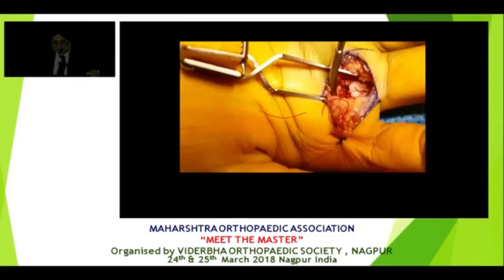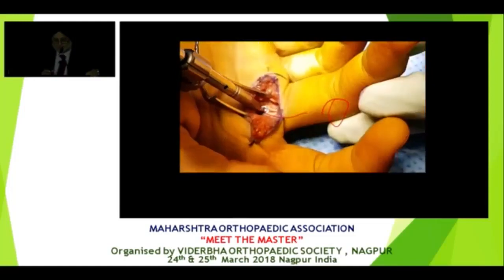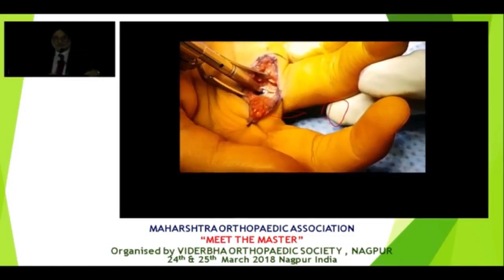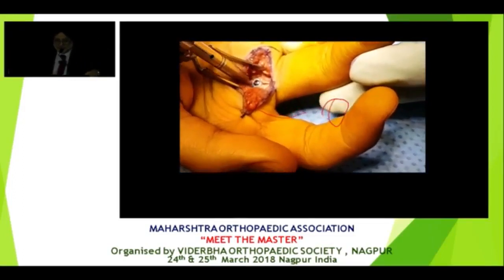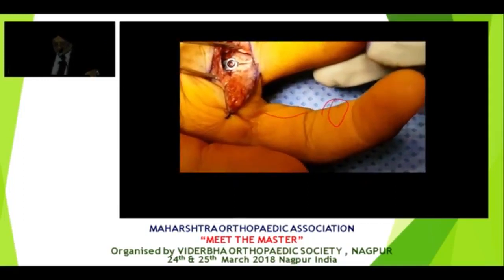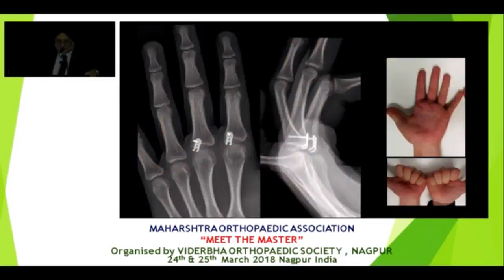Now this is like doing a volar plate on the radius. You can't see the joint line. So you put your fixation and you get an X-ray to check your reduction. So here we are putting our hook plate in there. And that's what the X-ray looks like.